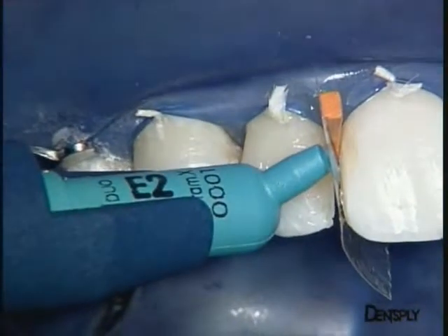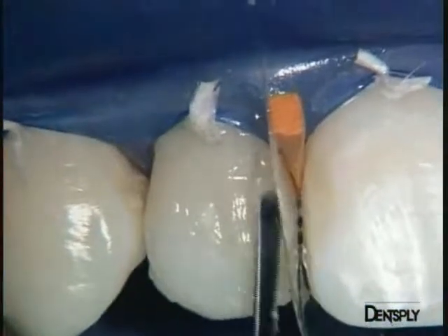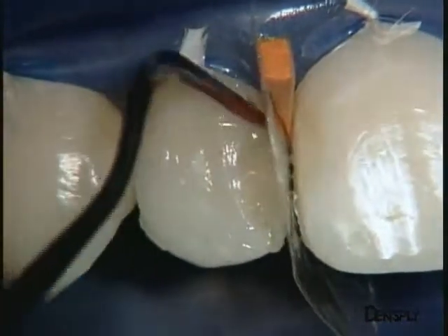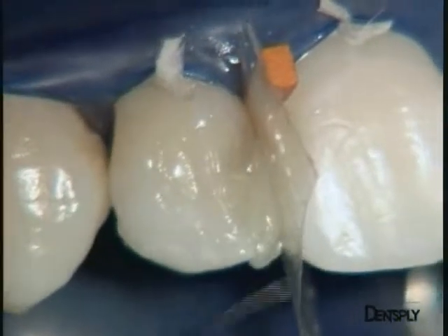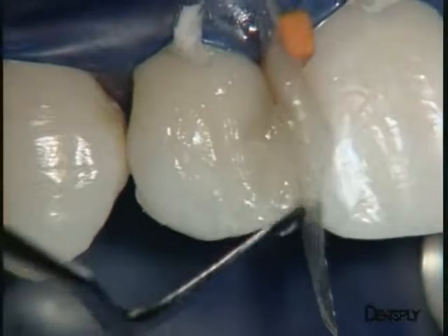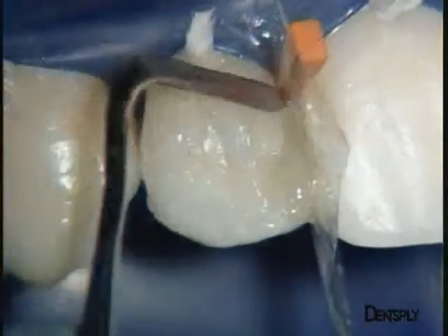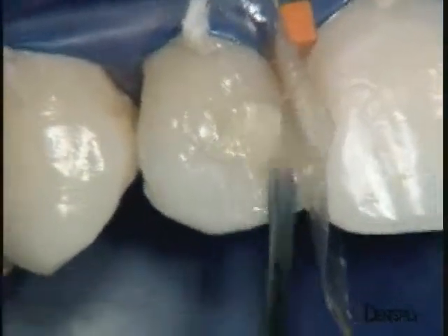We can now move straight on to building up the vestibular transition line with enamel replacement material E2. A matrix band is placed to avoid sticking to the adjacent tooth, and a wooden wedge to separate the two teeth. We then turn to the bulk of dentine replacement using D2, working up towards the vestibular surface. Moderate pressure is applied to each layer to eliminate bubbles, and each layer is polymerised with the SmartLight PS LED curing light.